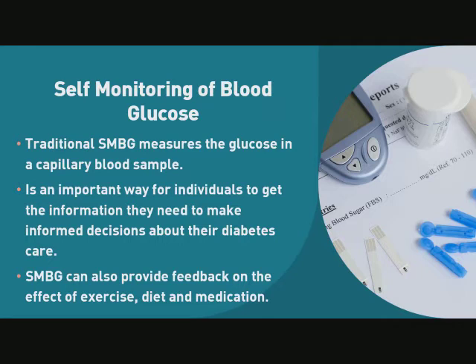If I'm about to exercise and I don't know, walking for 30 minutes or going to the gym for 1 hour, how much does it usually lower my blood glucose? Then I get to check before the exercise and after the exercise, and I see the difference, and I can get the picture about how much exercise lowers my blood glucose.